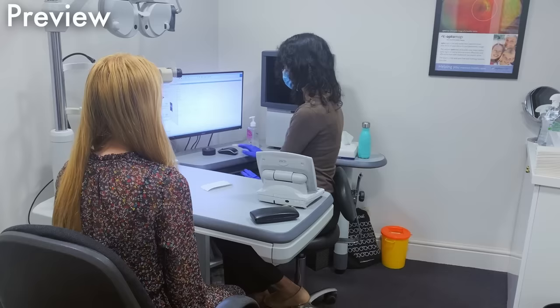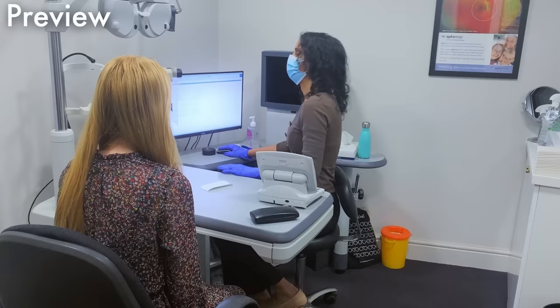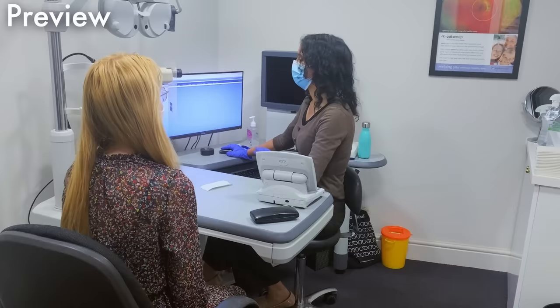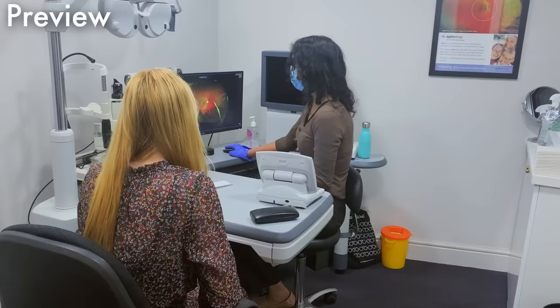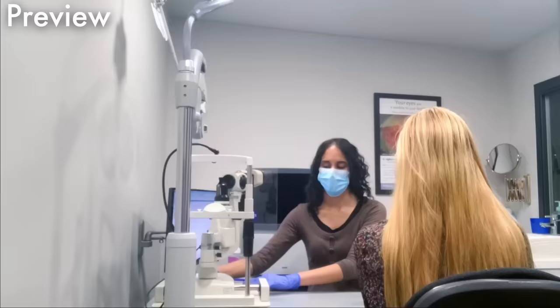Good. So now then I'll just show you what the photograph of your retina looks like. So this camera that we have is a very useful one because it looks much further out into the periphery of the retina. So we get a much wider and better view of the retina in general. Good. So this is your right eye, first of all, your right retina. Good. So your retina is looking great, perfectly flat and intact. Lovely. So I'll slide this machine across. So this one would just be a bright light.